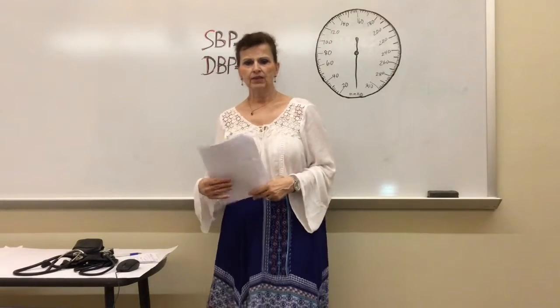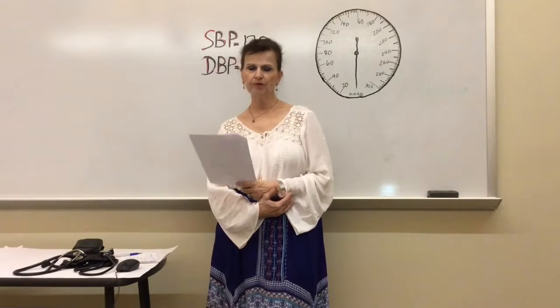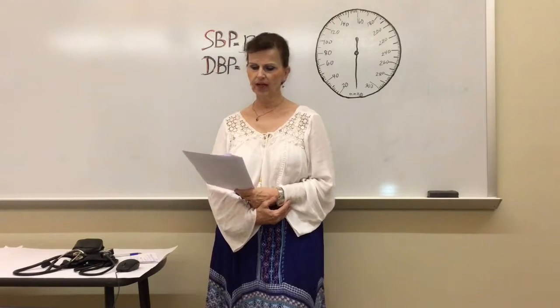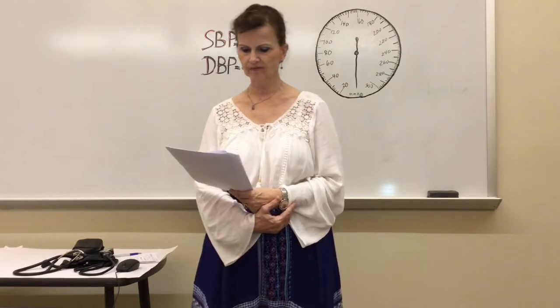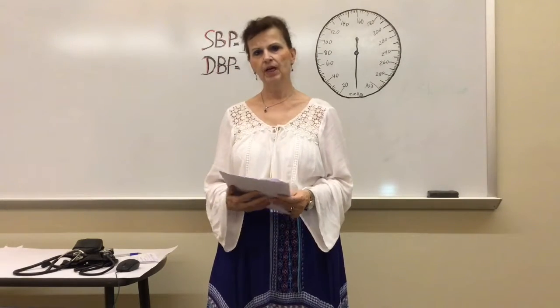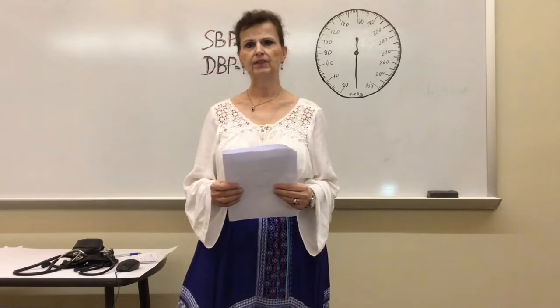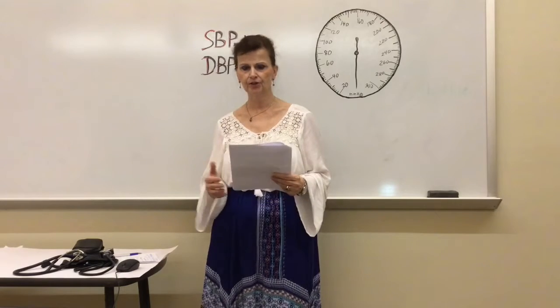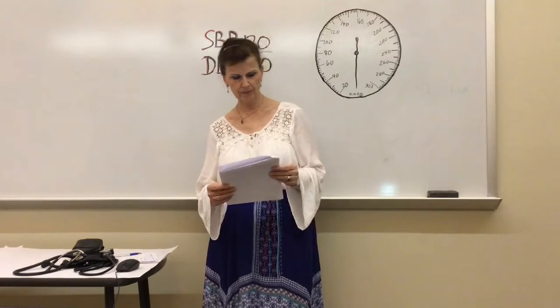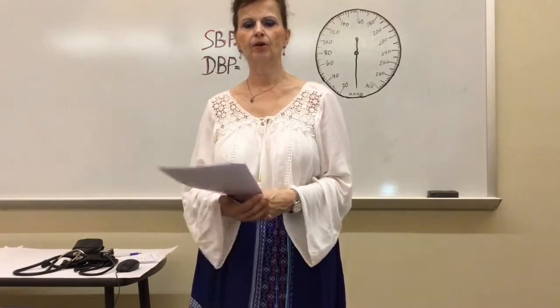A correct size is one of the most important factors that can influence the accuracy of a blood pressure reading. Most adults require a large cuff, and once it is put on, there should be at least 2 fingers that fit underneath before you inflate it. Studies have shown, evidence-based practice, that the upper arm is used.